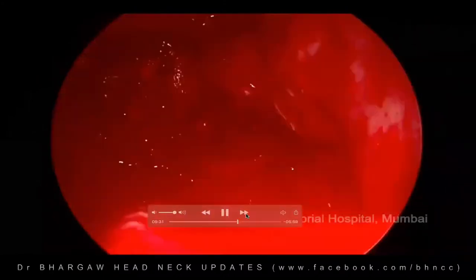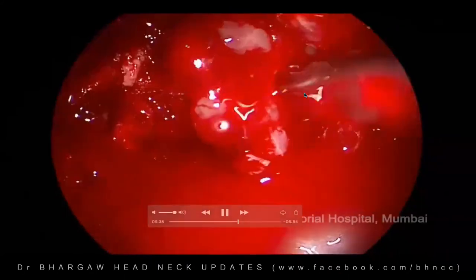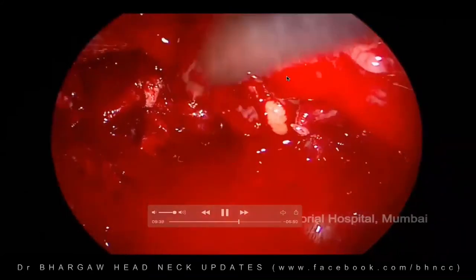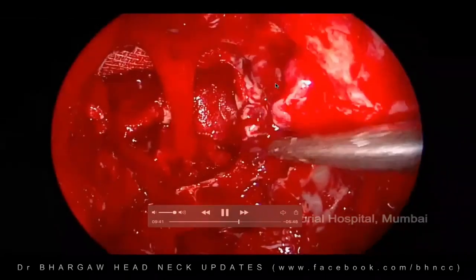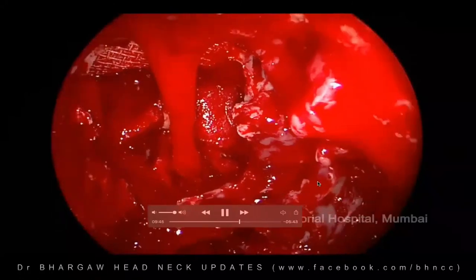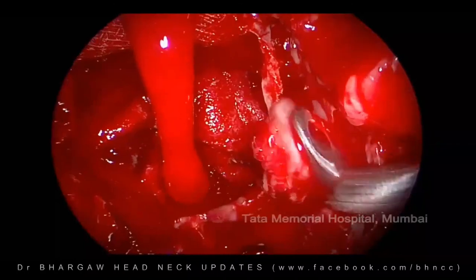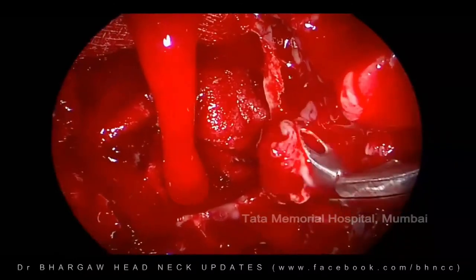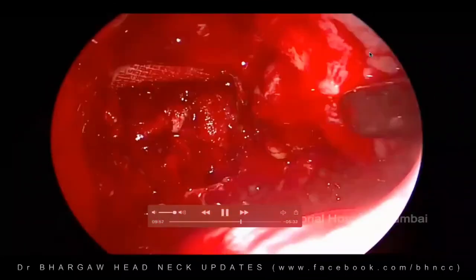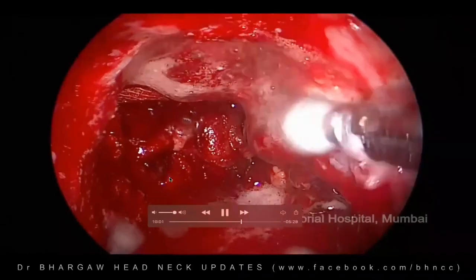So this is the antrostomy on the left side now. Now this disease here, which we see, is adherent to the lamina papyracea, which is eroded. It's close to the fat here. So we are just debulking the disease, and then you'll see what happens. That's the edge of the bone there. That's the superior orbital, yeah, that's the base of the skull there. And that's disease that is close to the bone there. We're just drilling away the bone.